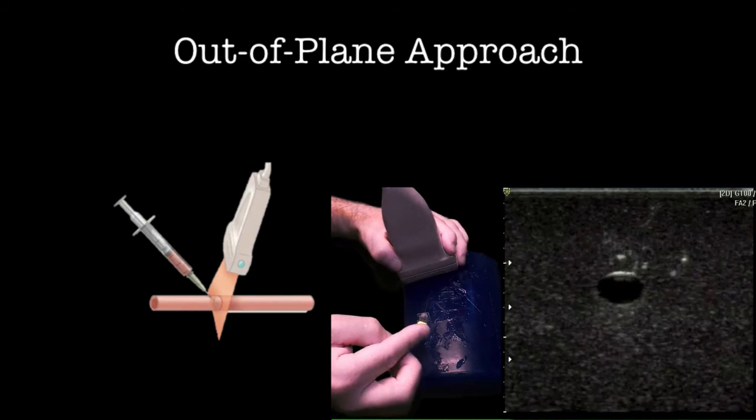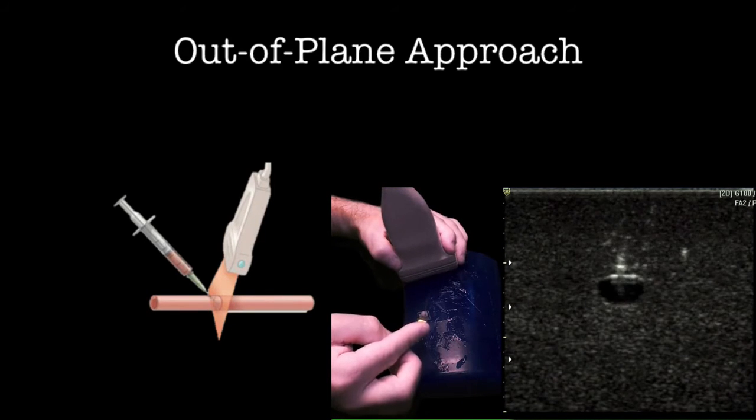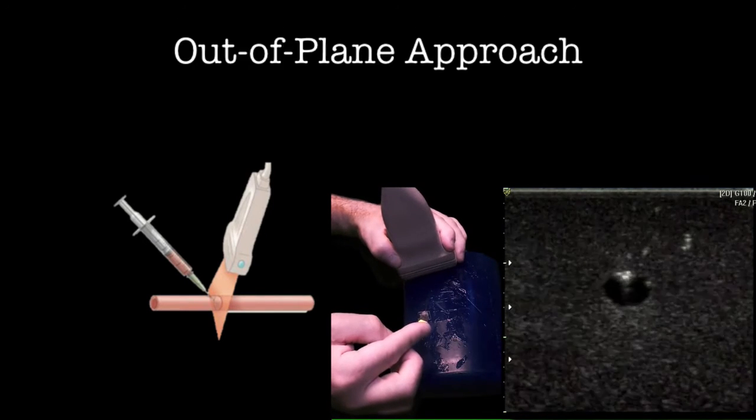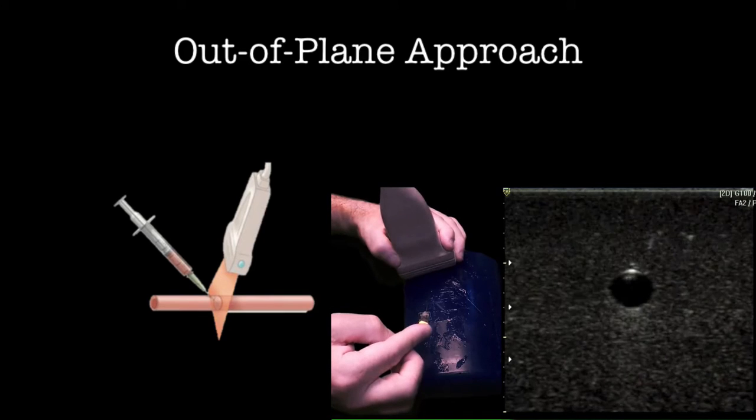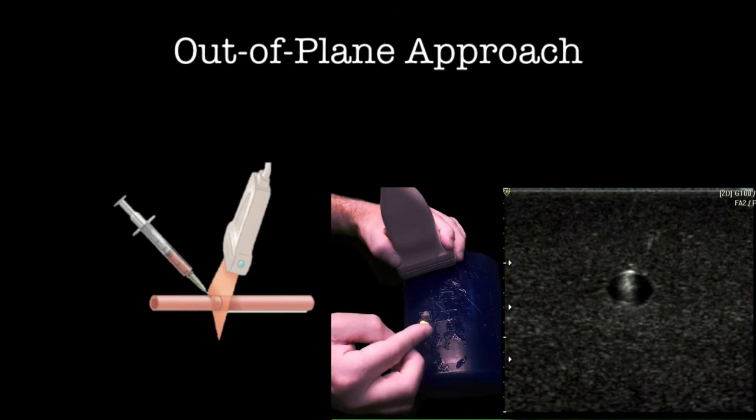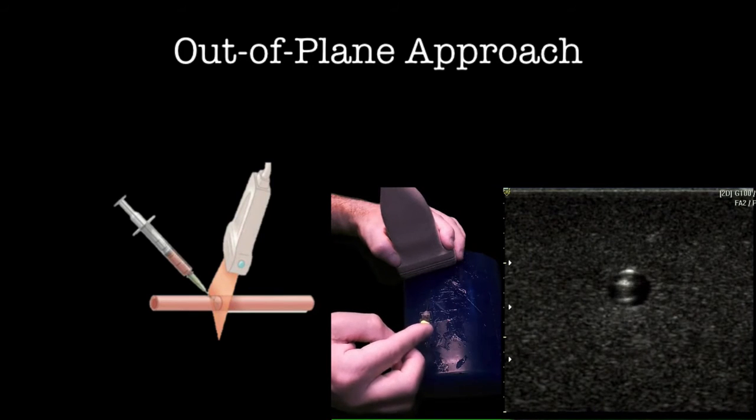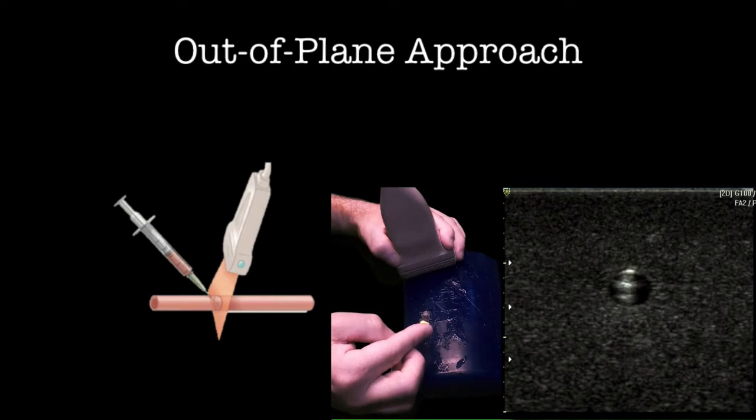Once the needle is seen, stop moving the needle and slide the transducer further up the vein. This process is repeated until the needle is centered in the vein lumen. This is walking the needle towards the vein. The probe is moved up the vein, then the needle slid into view. Probe then needle.